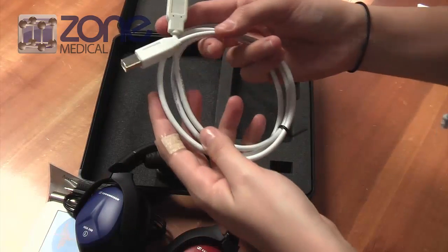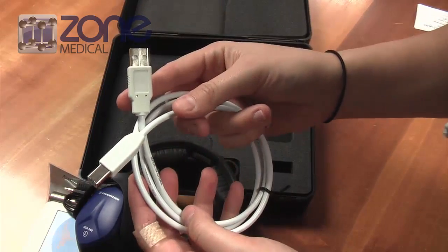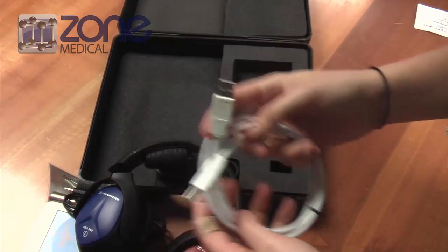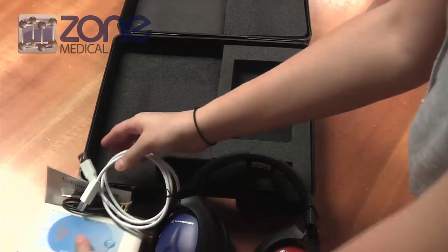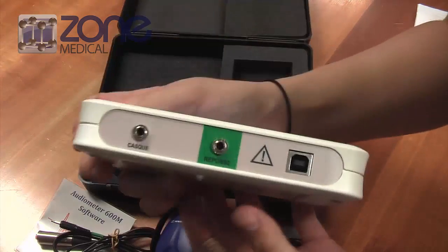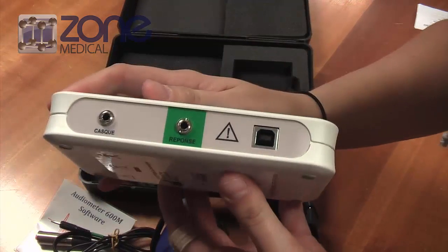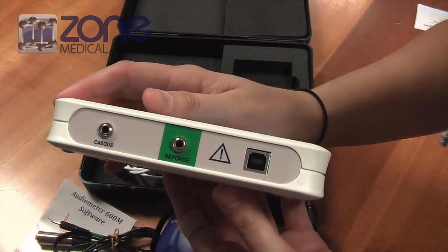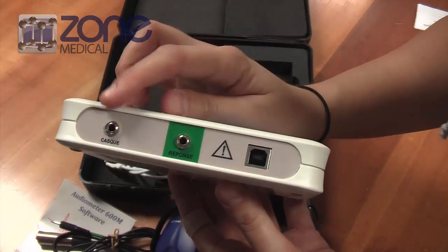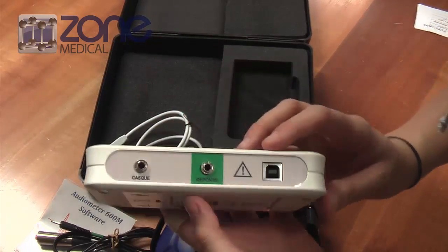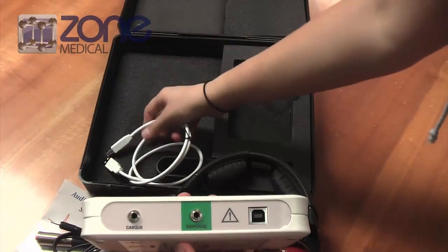To set up the device, you'll need to plug all of these components into the audiometer. The audiometer has three different ports: one for the headphones, one for the response switch, and one for the USB.